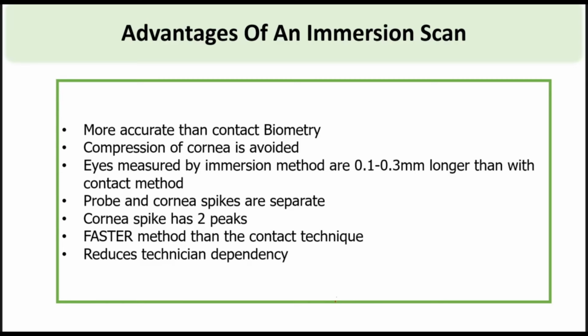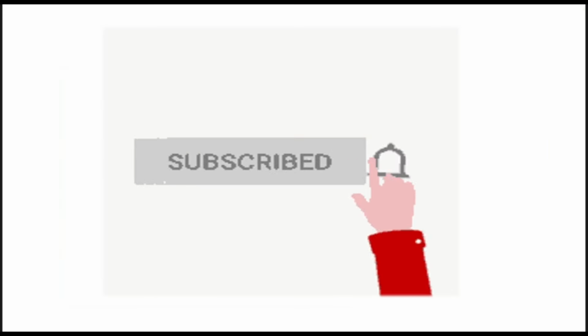Now, it doesn't mean that the contact biometer is useless. Actually speaking, in good hands, it can give you really good and comparable values. But when the technician is not as experienced, in those cases, an immersion scan or an optical biometer is a much better choice. All right, so that's all for today.